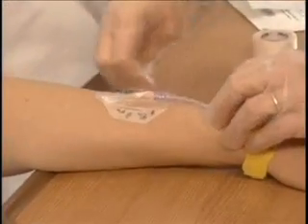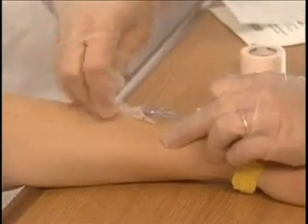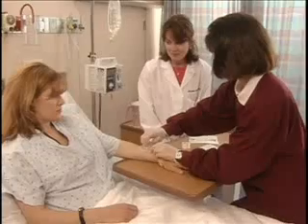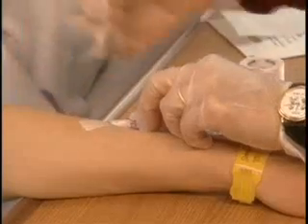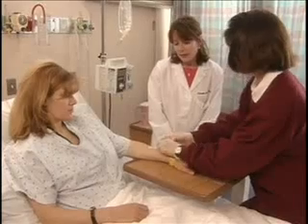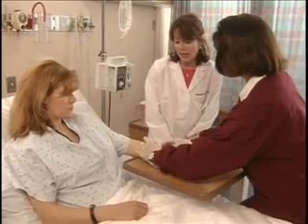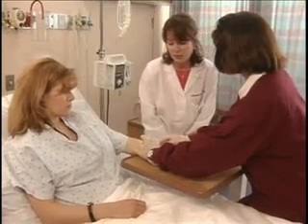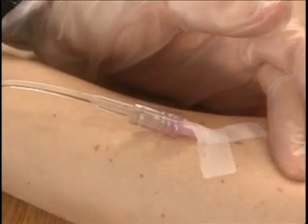Okay, you can remove the dressing. Now you want to apply gentle pressure with your hand at the end of the catheter under the skin when removing the existing tubing. This will prevent blood from exiting the catheter hub when the tubing is removed.